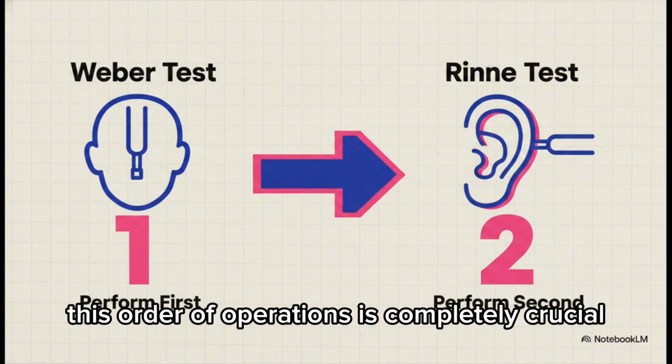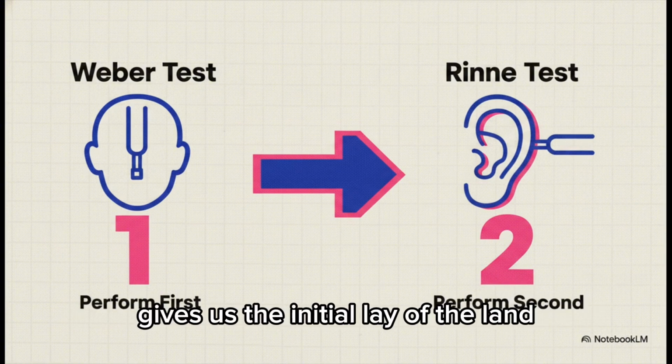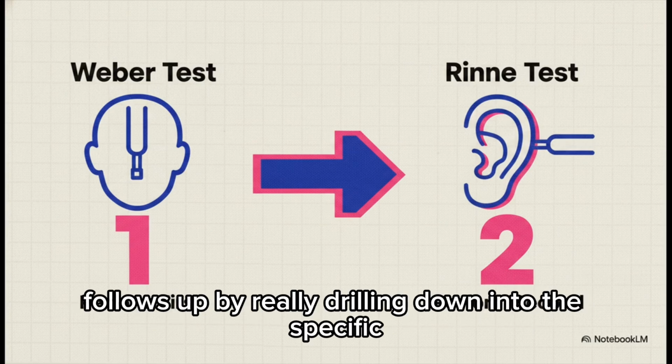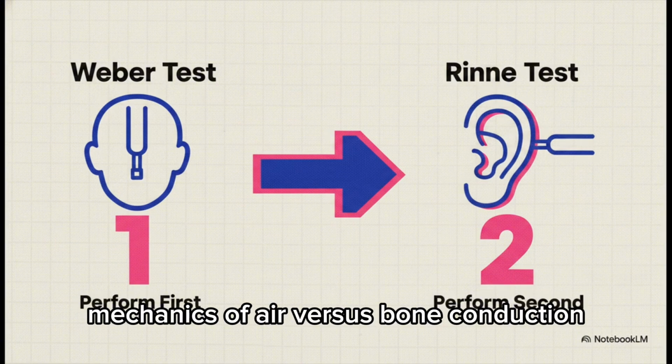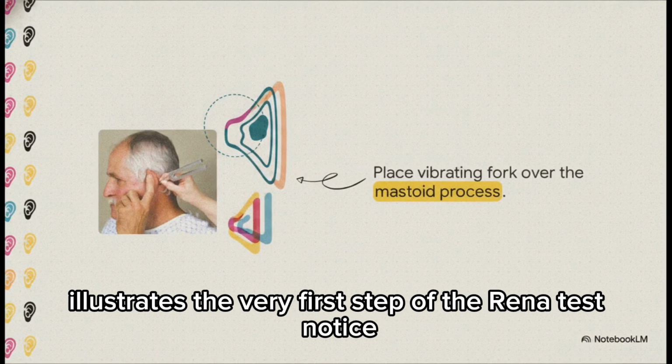This order of operations is completely crucial. Think of it this way. The Weber test gives us the initial lay of the land regarding lateralization, and then the Rinne test follows up by really drilling down into the specific mechanics of air versus bone conduction in each individual ear. And this brilliantly illustrates the very first step of the Rinne test.